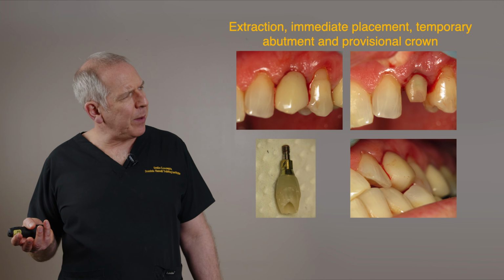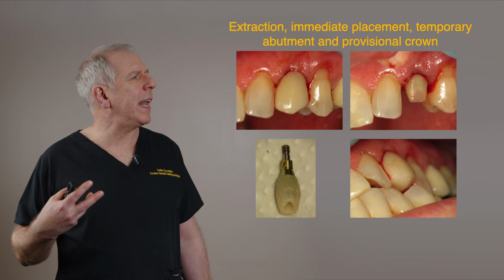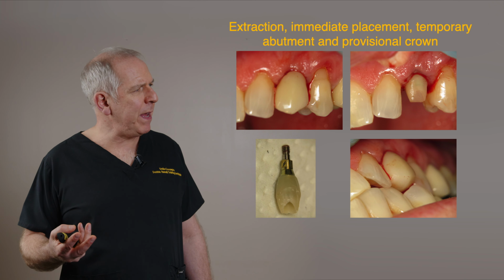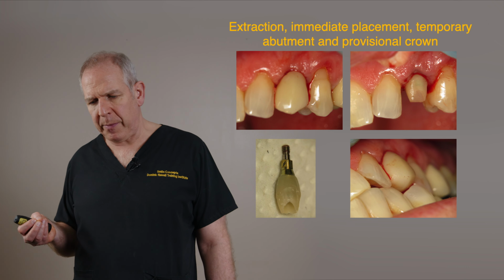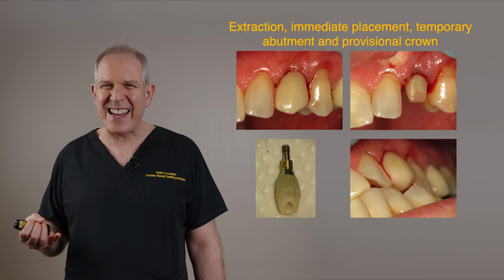But look at the immediate placement and see how it preserves the papillary area and it preserves the buccal architecture of the gingiva. Now, immediate placement is really not for the realms of this presentation today, but do remember, for immediate placement, really you need a case that's easy.